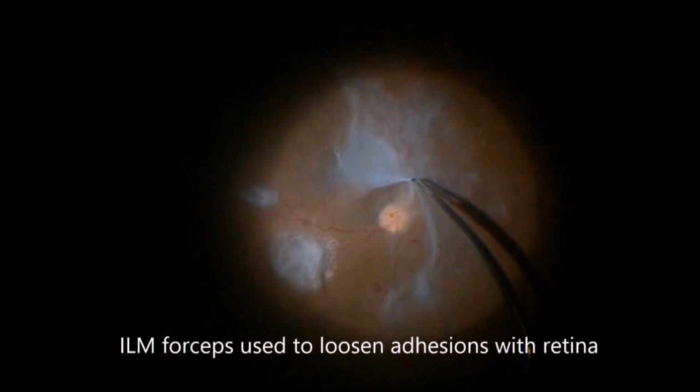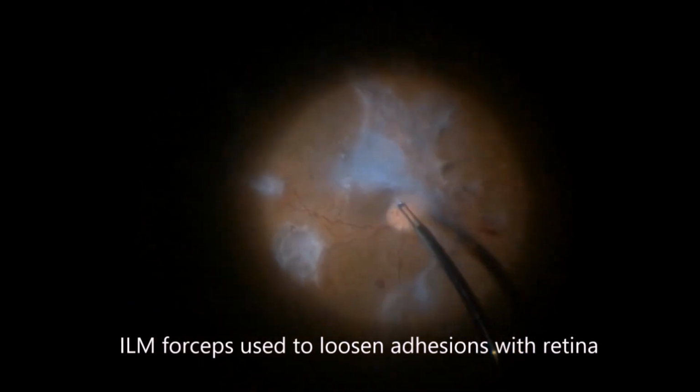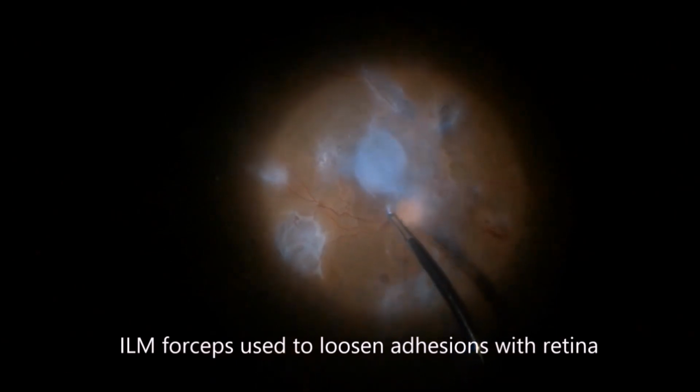In this video, we'll be showing the use of PFCL in the management of diabetic vitrectomy. In the first video, you can see there is a thick hyaloid face which is very firmly adherent to the underlying retina.